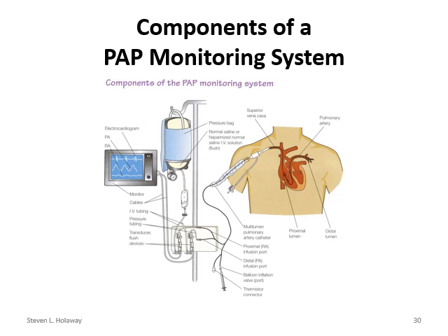So this is the whole system. When you look at it, basically we've got the pressure bag like we've talked about before. We've got our catheter. It's hooked up going in. Now, all the catheters now have a little sheath over them, and that's to maintain this portion sterile. And the reason we want that is if we have to advance the catheter for some reason or have to pull back, we want to keep that part sterile. Okay? For that, you can see our balloon port, and you can see basically a transducer port here.